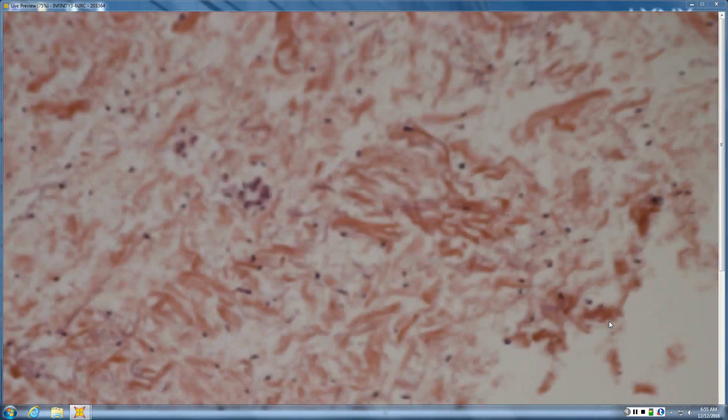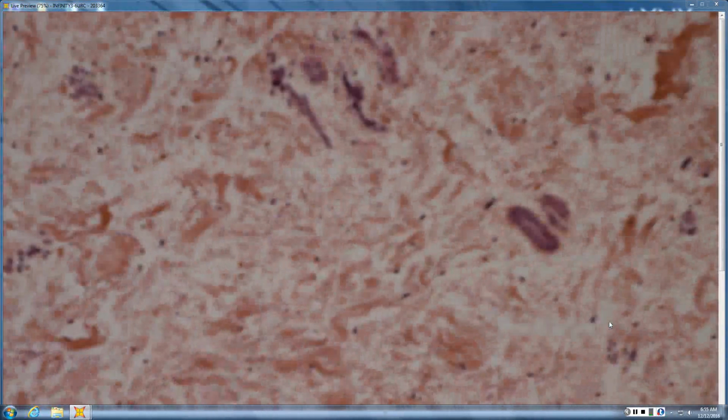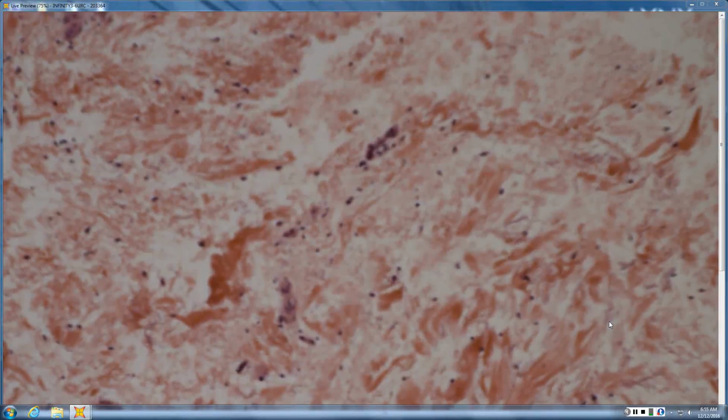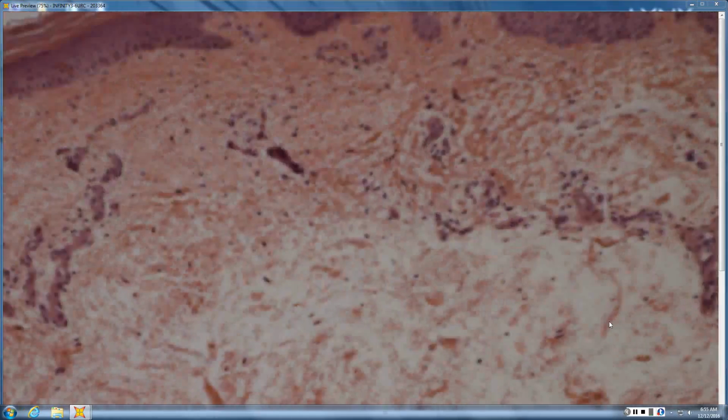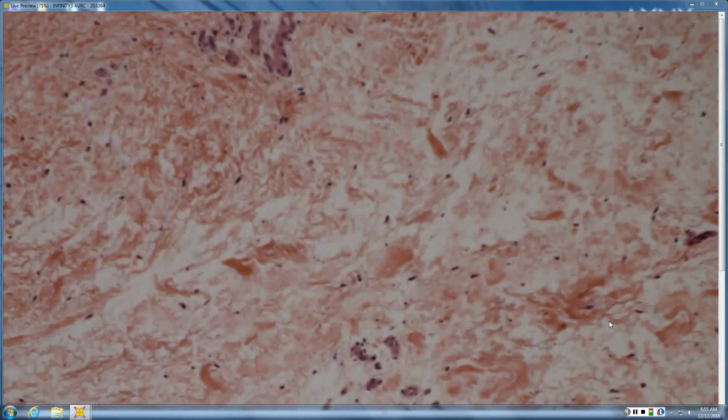It's not a thickened biopsy necessarily. Okay? So, what do we think? Is it myxedema? Is that enough? So this is pretibial myxedema. And like I was talking about, the way that you differentiate it from scleredema is that it's not deep. It's the full thickness of the dermis where you get all of the deposition of things.